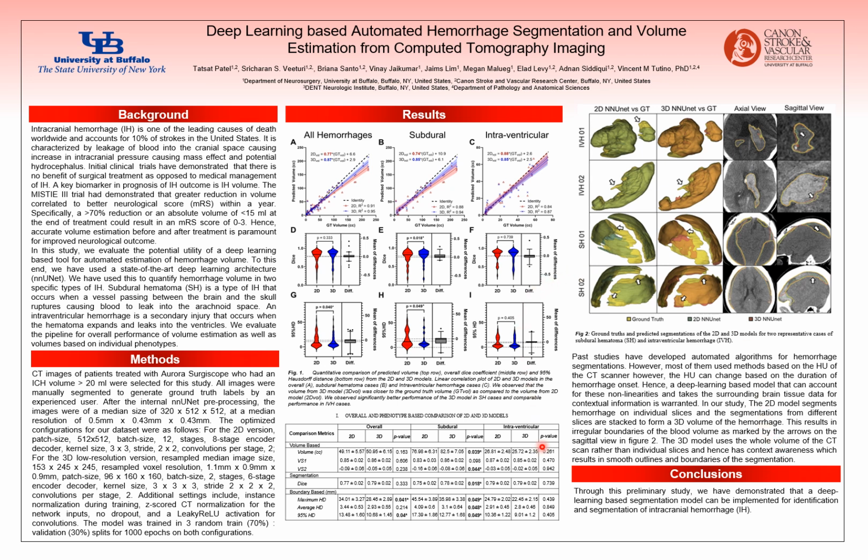So in this particular study, to conclude, we demonstrated that a 3D nnU-Net is performing better than the 2D nnU-Net and has a closer estimation. Now, the advantage of using this in a clinical setting is the time it takes for segmentation is saved, and you get a very good approximation of the hemorrhage volume.